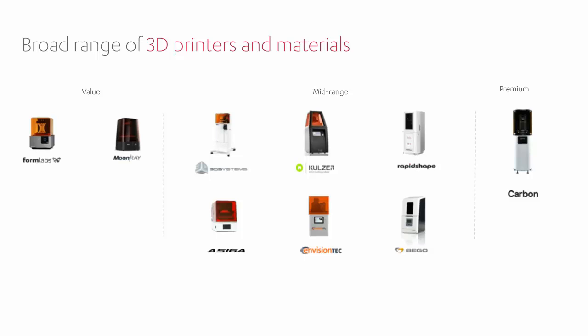You can say the real deal here is actually not so much the printer, but even more the material. The good news is there's a number of different companies that are working intensively on bringing new generations of printed materials, and there's no doubt this is the end game. There might still be a little bit of challenge on the aesthetics, but this is the end game, and we will print all dentures, and I believe this is going to disrupt. Most likely the Sirona solution, the Carbon Sirona solution, is already starting to disrupt the whole way we have dentures made.